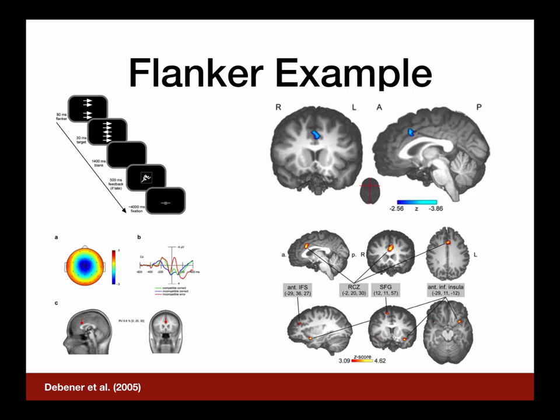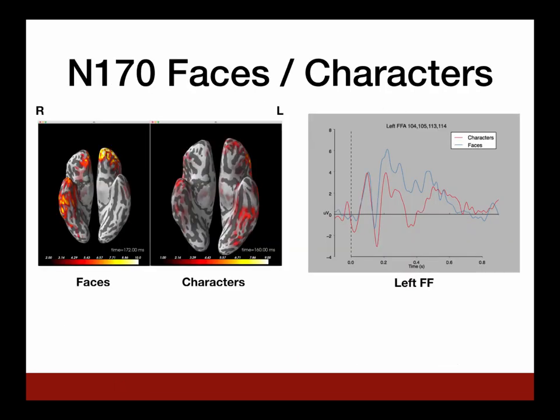And when you make a big mistake in any task, and we're recording your EEG, your brain gives off what we call an error-related negativity. It happens about 100 milliseconds after the incorrect response. And it tends to be this nice large negativity in the center of the head. And again, this is negative plotted up. We see here's the error versus here are the two correct down here.